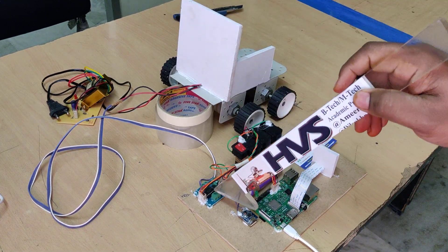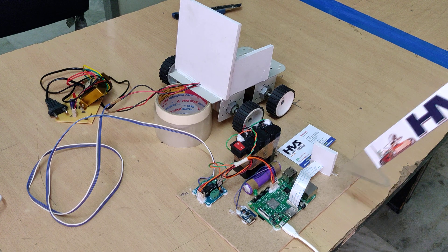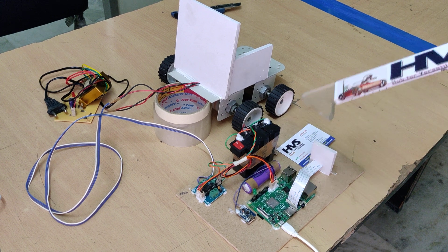The motors are driven through the L293D motor driver. We are making use of Raspberry Pi 3 and Pi camera: the Pi camera is for detection purposes and the L293D motor driver is for control purposes. The whole system is driven by two batteries.